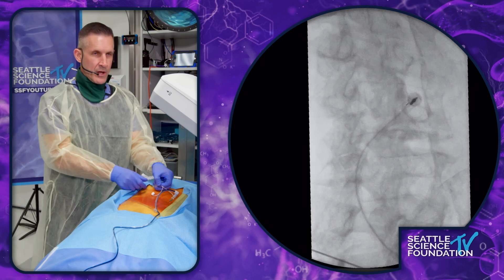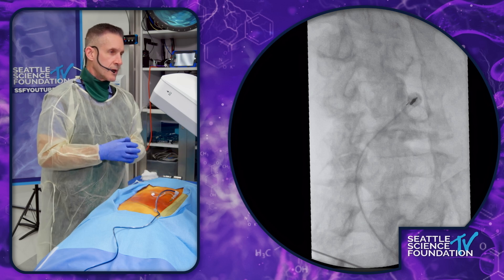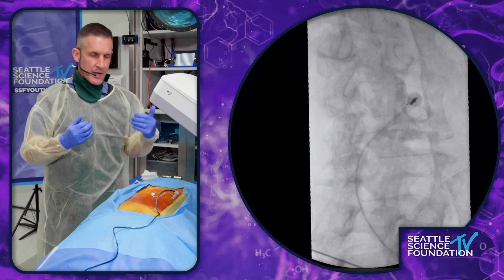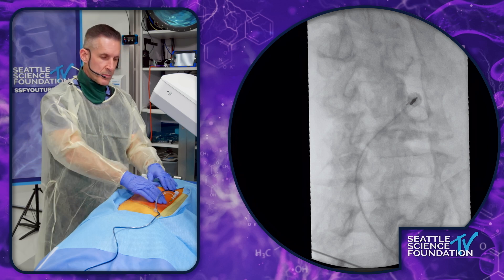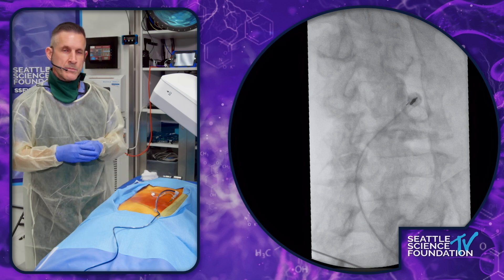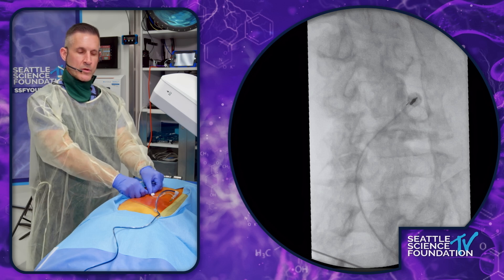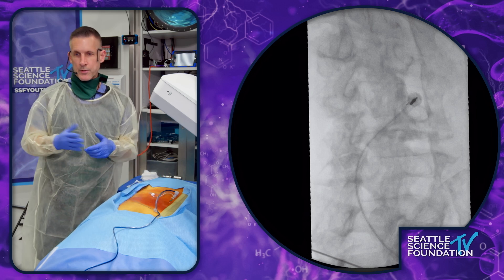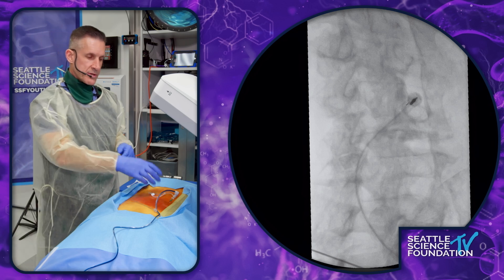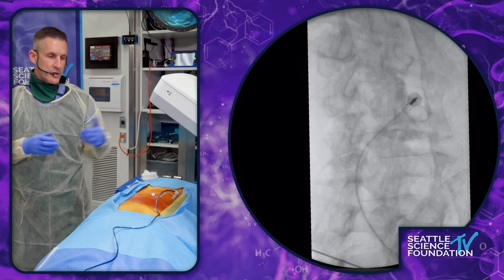When you have that position, we'll do sensory and motor testing if the patient's awake. If the patient's asleep, we'll just do motor testing. Once we have a good idea that we have maybe a little multifidus stimulated but no distal stimulation in the lower extremity, we go ahead and do just a little bit of local anesthetic and do our lesion. In particular, this lesion is for two and a half minutes. Typically I'll place all of my needles on the side I'm working on and then lesion them all at the same time.